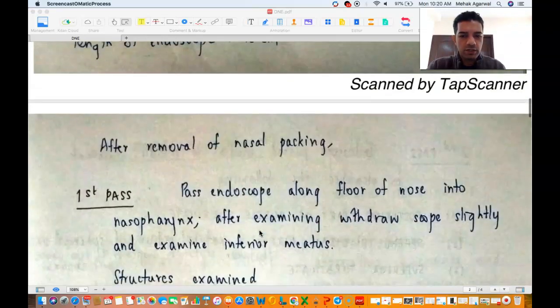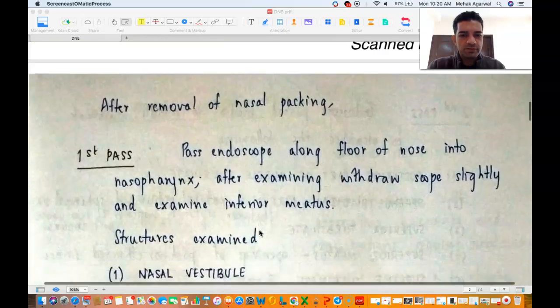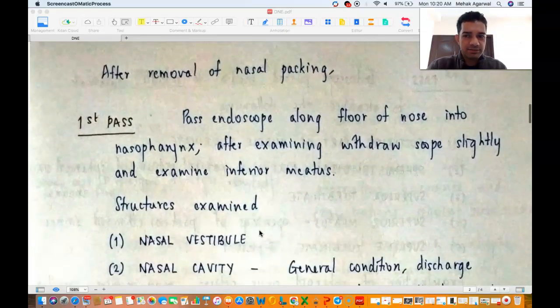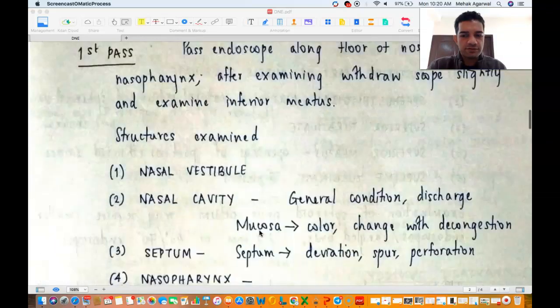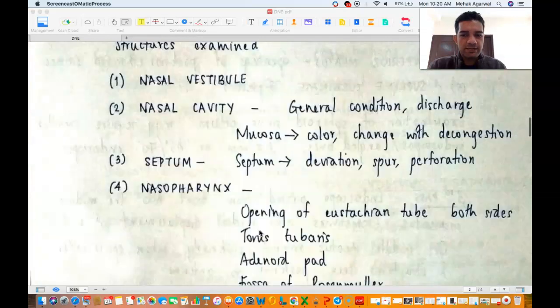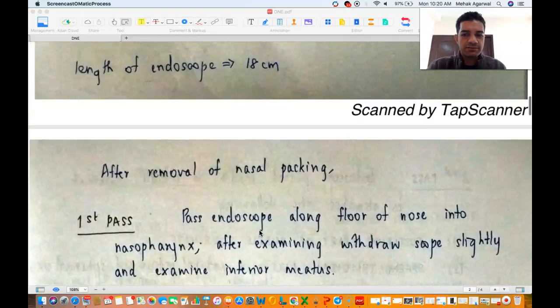After you remove the nasal packing, there are three classic passes that are explained in all undergraduate textbooks — the first, second and third pass — and we shall see what these passes mean.